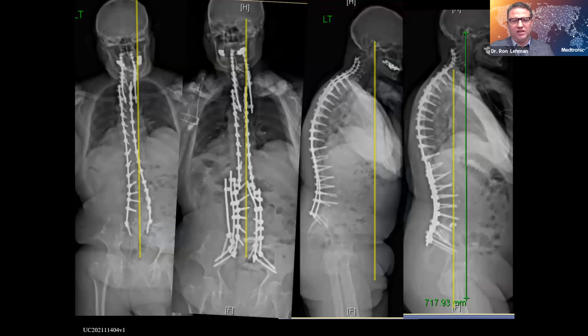And so you can see we dumped all the rods we had in the hospital into his spine there. We have 5 rods going across that lumbosacral junction. Used the robot to place screws very accurately and very quickly in his fusion mass. And then used multiple dual-headed screws, as you can see here, to really link these up side to side. So it's a really nice application to do.